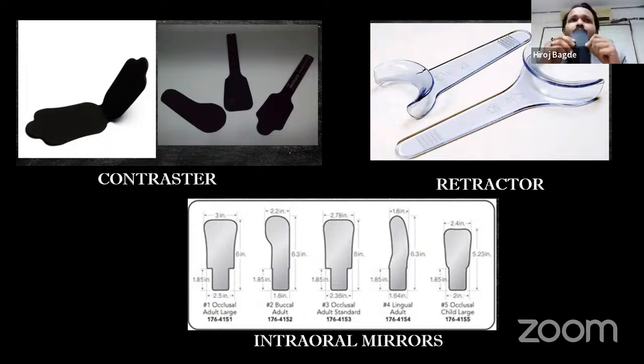Then, less than that is the stainless steel mirror, because these mirrors are very sensitive towards scratches. So I should be very gentle while using these mirrors, because once a scratch comes, whenever I take the image as a mirror image, the scratch will definitely be seen on the photograph. So it is not good for any type of recording. Whenever buying, it should be good. So my suggestion will be a rhodium coated mirror.